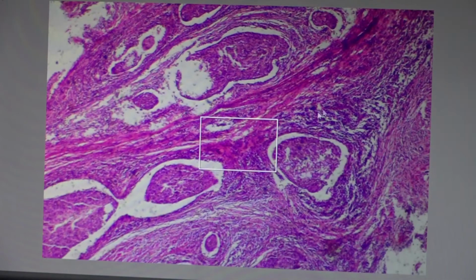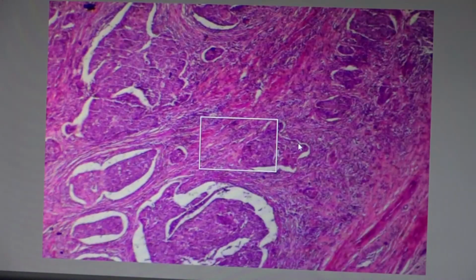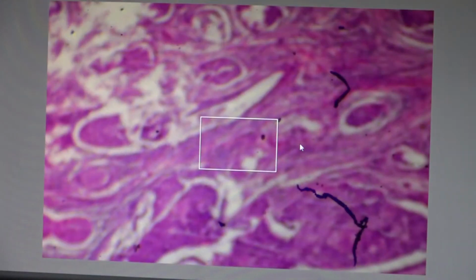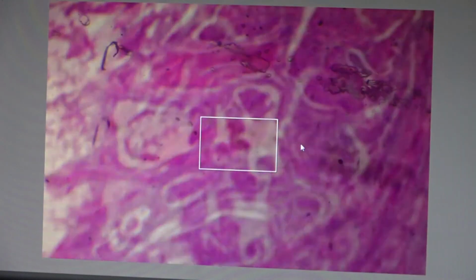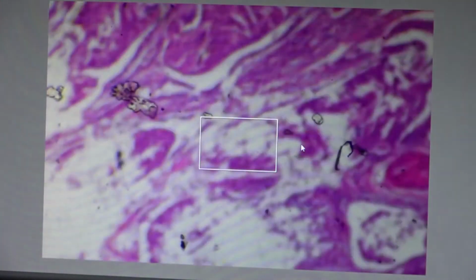This is another pathology of the female genital tract regarding malignant tumors. This is a malignant tumor of the cervix of the uterus. This is squamous cell carcinoma. The tumor is showing multifocal malignant aggregations of malignant cells and epithelium infiltrating the whole tissue of the cervix.